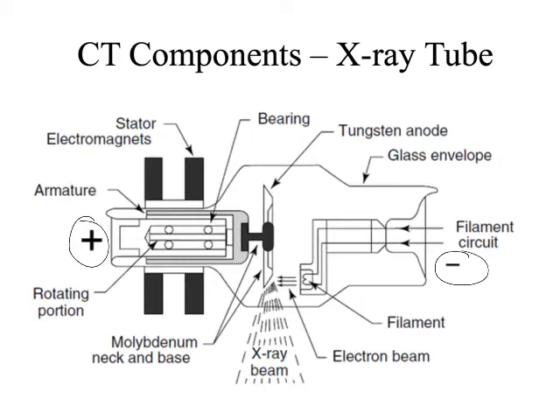It's like when God was inventing elements, he came up with tungsten so that these gorillas could make X-ray tubes out of them because it's perfect for that.